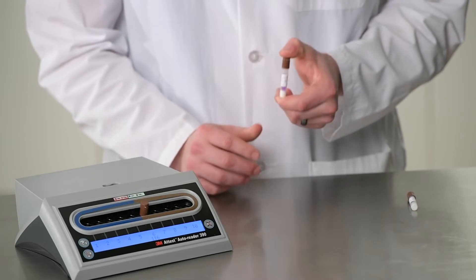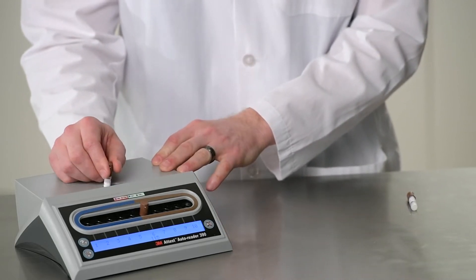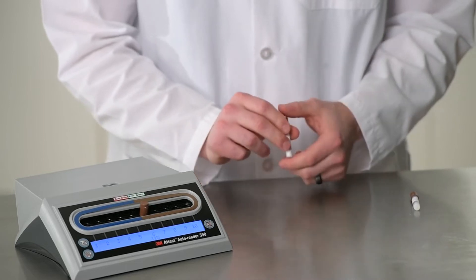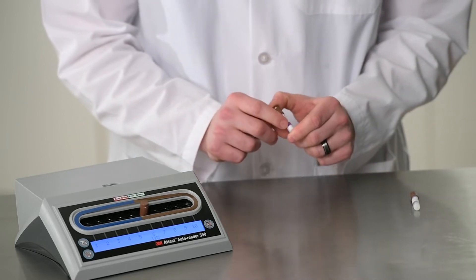For rapid BIs, once cool, you want to close the cap. You want to crush in the crusher well located on top of the 3M Autoreader. You want to tap on a hard surface, and this tapping will ensure that the growth media is making its way down to the spore strip.